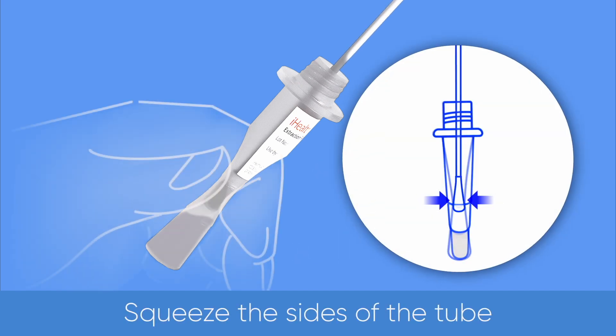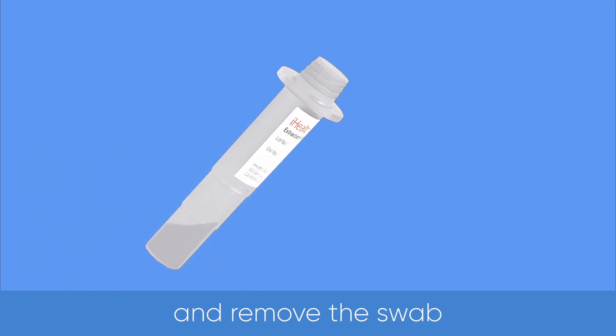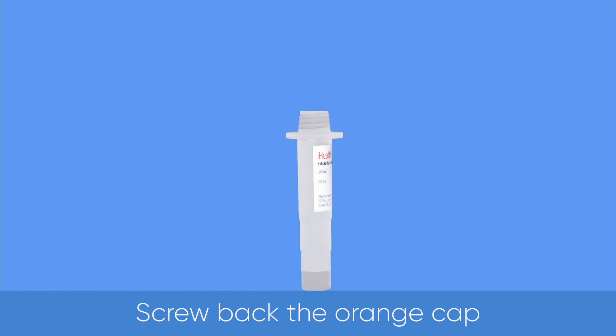Squeeze the sides of the tube to express as much liquid as possible from the swab, then remove the swab. Screw back the orange cap.